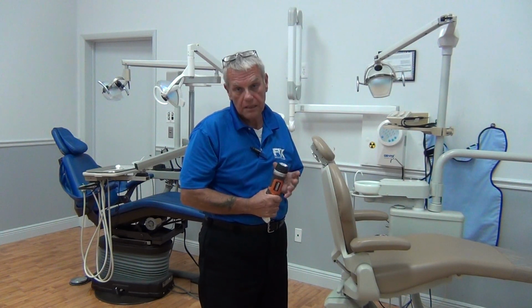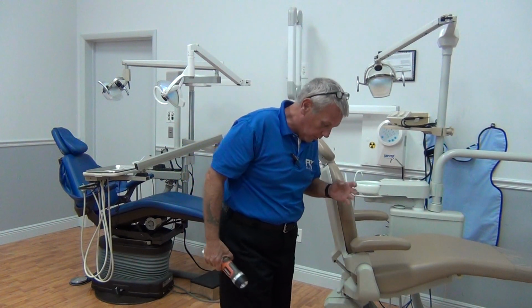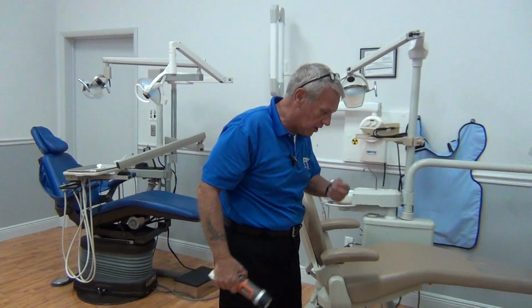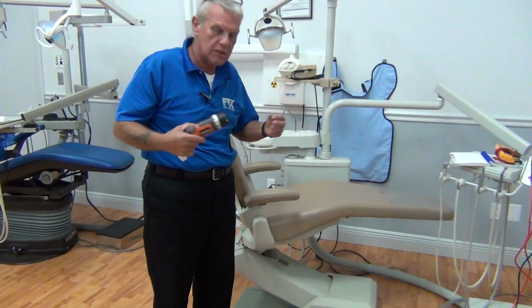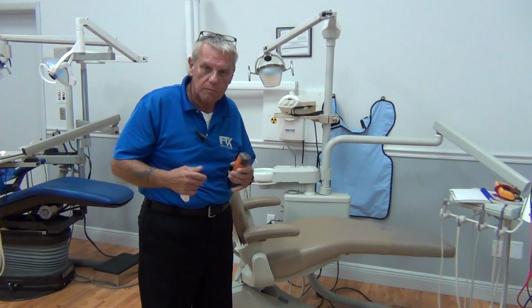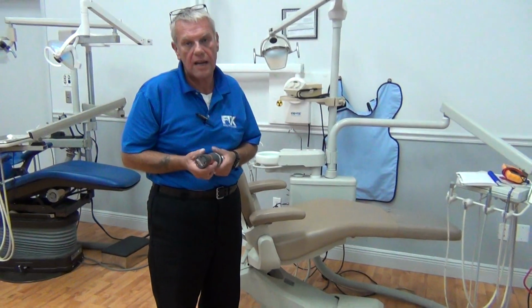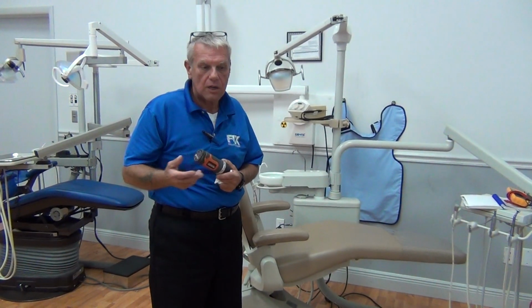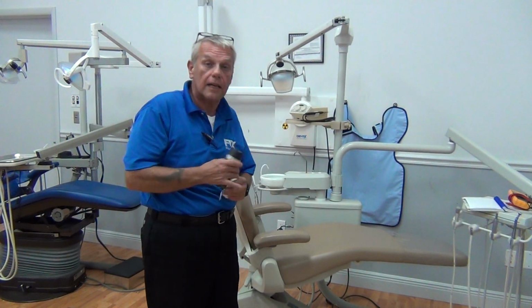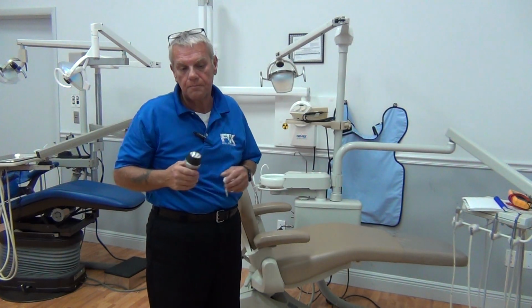Now, let's do a little bit more PR. Doctor, are your preset parameters okay for you, sir? Does the chair go as high as you like? Does the chair go as low as you like? Are there any particular problems, complaints, remarks, anything I can help you with on this chair while we're at it? Yeah, I'd like the chair to go a little higher. I'd like the chair to go a little lower. I'd like the back to go a little further up. I'd like the back to go a little further down.